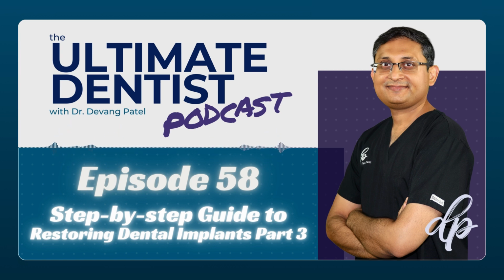Generally, if I find any inflammation around the implant, I tend to take the crown out and put the healing abutment in so that the patient can maintain hygiene properly, and then place the crown back in, and generally that solves the problem. With a cement retained crown, it's much more difficult, and that's why I prefer screw retained crowns.